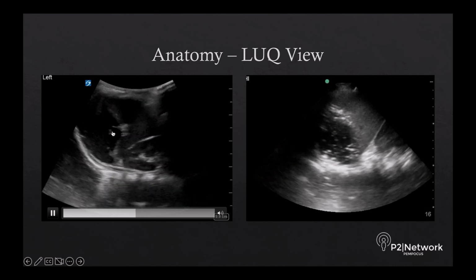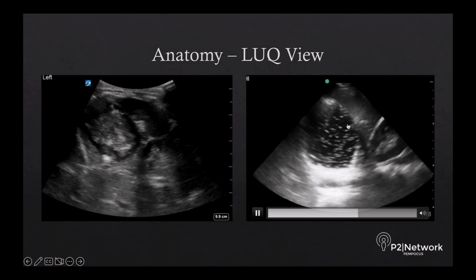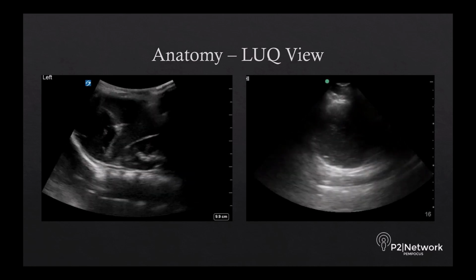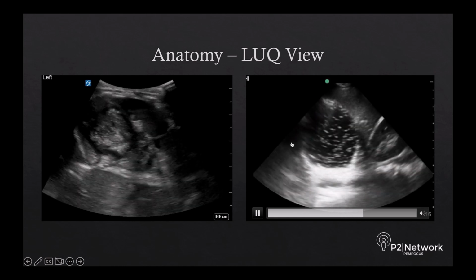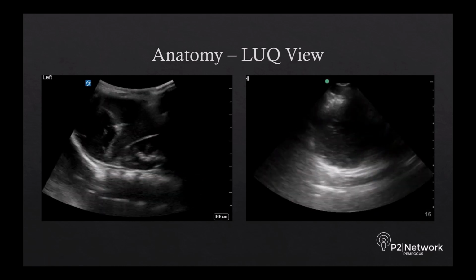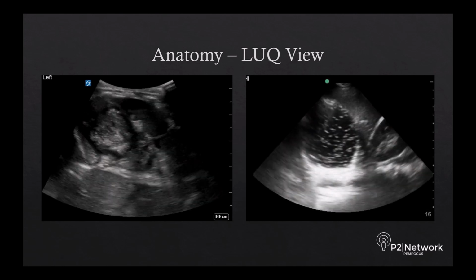And on the right, similarly, we've got our liquid content. In this case, we've got a bunch of admixed air bubbles. And what you note as we fan through intermittently, as you come up more anterior, you see this bright wave of hyperechoic signal coming in. That's looking up and seeing the air from the bottom up. And in this case, since you're below, you're seeing content below the air, and the air is shrouding what would be the anterior fields.